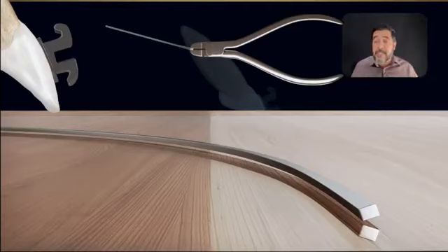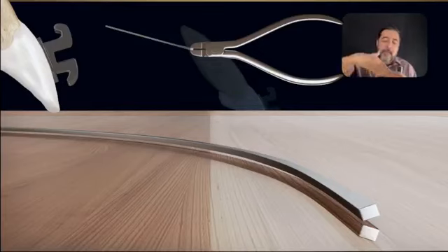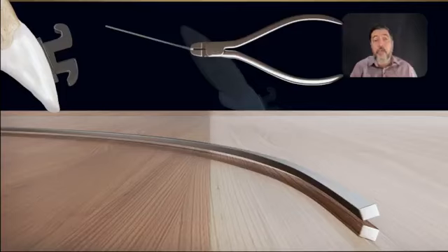I'm positioning the center of rotation of the movement closer to the apex, meaning I'm doing the inclination in a controlled manner, not an uncontrolled manner. So I don't want the apex of the root to go forward or backwards in some situations, and I want to keep them in their position.